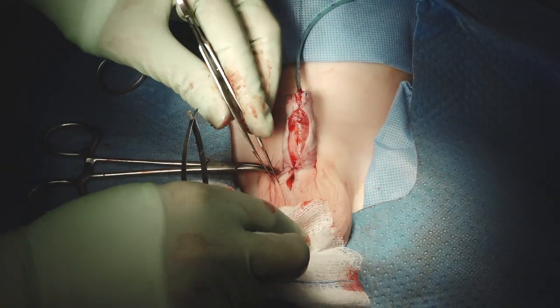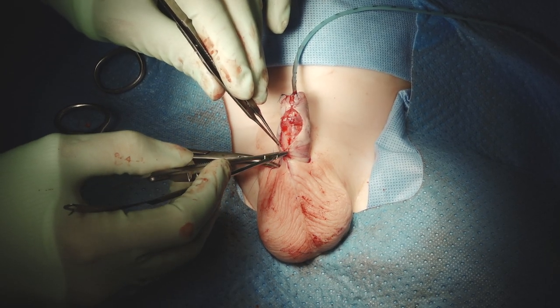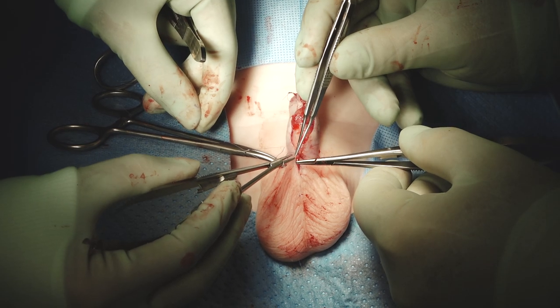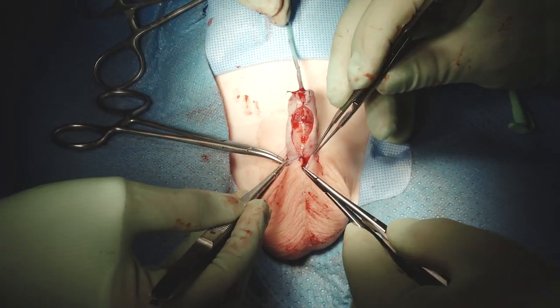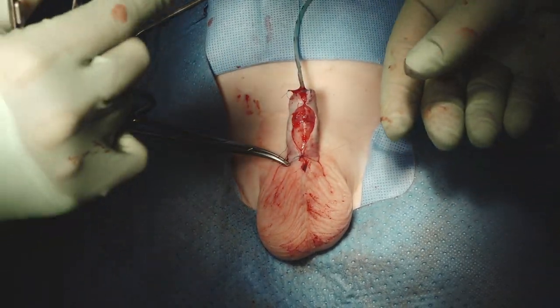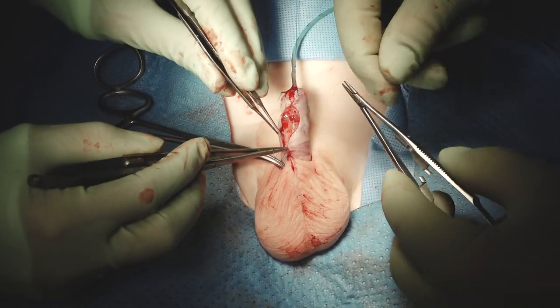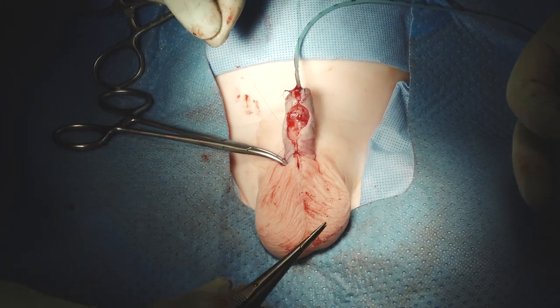There's this little scrotal incision here — if it's a longer scrotal incision we close it with a 6-0, but for this short one we just use a 7-0 Vicryl. We are going to stress in our master class series more about skin. It's interesting that whenever there's a course on hypospadias or a panel discussion, it seems almost always focused on the urethroplasty. Every now and then there's a special emphasis about straightening curvature, but never is there an in-depth discussion about nuances of skin closure — and we've learned how important it is, not just from the aesthetic standpoint but from the functional standpoint.